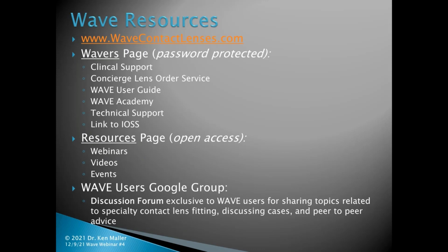I've learned in the past that when I use a slightly higher oxygen permeable material, they also tend to flex a little more, and I get more vision complaints. So again, here's a case where we're balancing physiology in terms of the material versus the vision. I think that's always a balancing act that you have to weigh out on a case-by-case basis and decide which things are going to be the most important to make the case successful, whether it's making the cornea and the eye happy physiologically, or making the patient happy visually, or making you happy when you're looking at that lens on the eye.